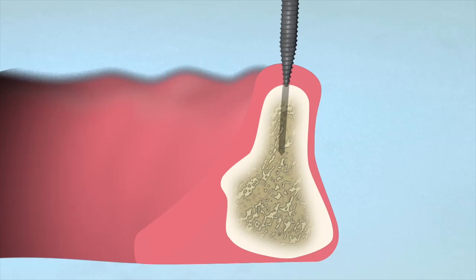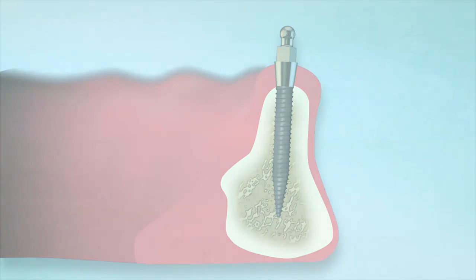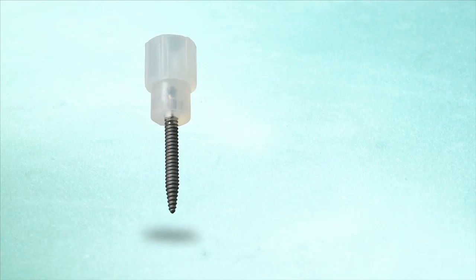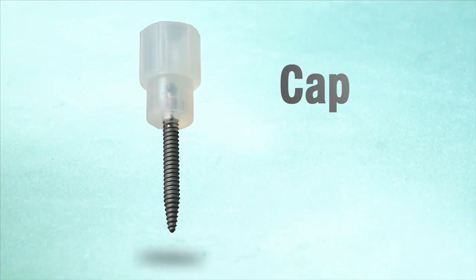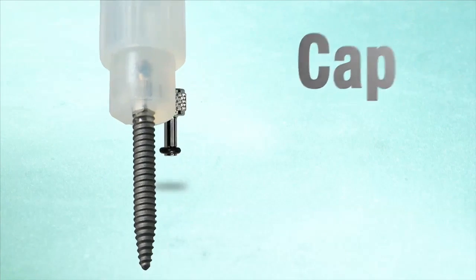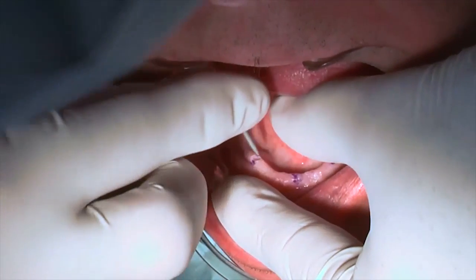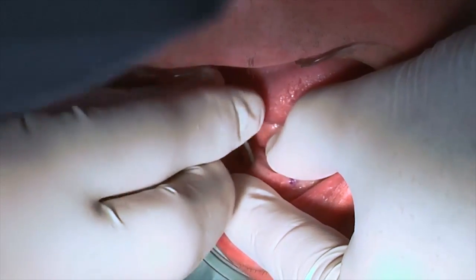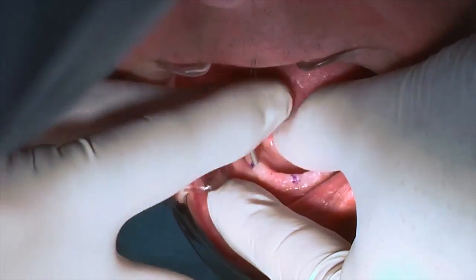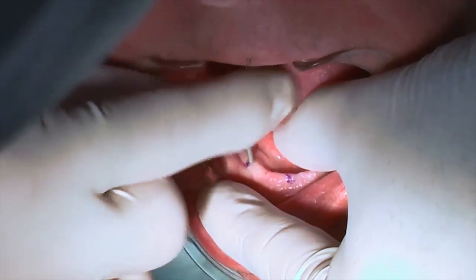The threaded implant is self-tapping and will use the non-drilled bone to provide immediate secure fixation. Remove the first implant from the vial using the attached cap, or use sterile titanium pliers to hold the implant in order to remove the cap and immediately place the finger driver. Carefully align the implant, insert the tip into the pilot hole, and turn clockwise with even downward pressure so the implant threads engage bone.